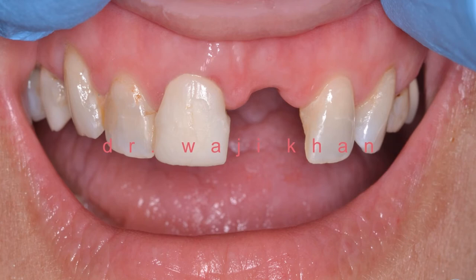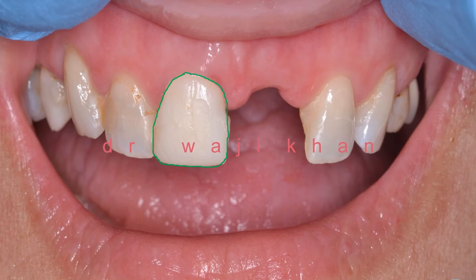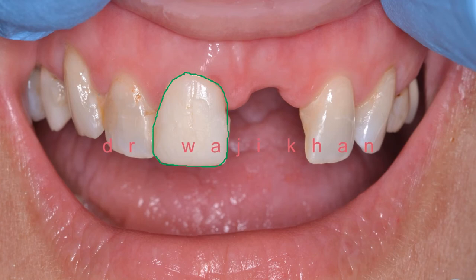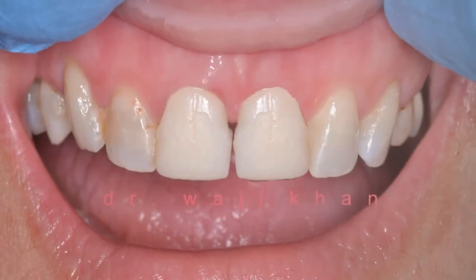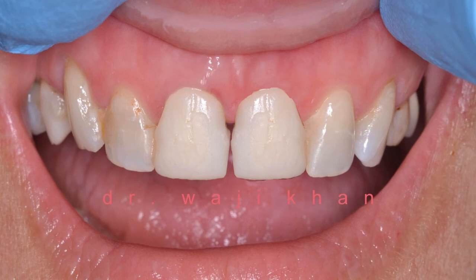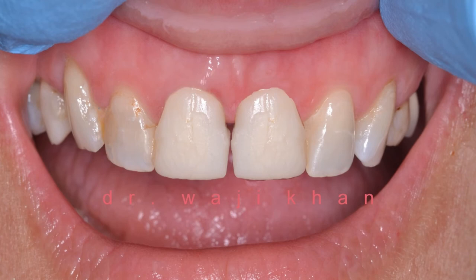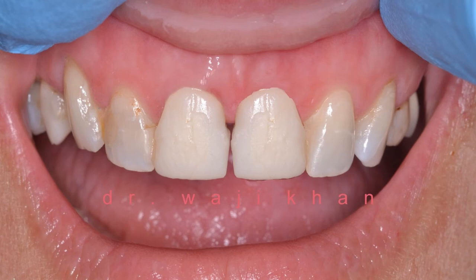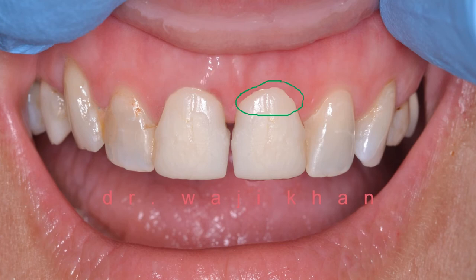Using Photoshop at this stage, you take the lasso tool and trace around the contralateral central incisor. Referring to the principle of dominance of central incisors, you copy it, invert or mirror it, and move it over. This shows you what any mesiodistal deficit is going to be. In this case, without addressing the 1-1, we would have ended up with a very wide 2-1 crown to fill the space without a diastema. You can also assess from the apical aspect whether there will be any soft tissue void — in this case there isn't — though a future case will demonstrate how this tool advises you when connective tissue augmentation is needed to avoid teeth of different shapes.